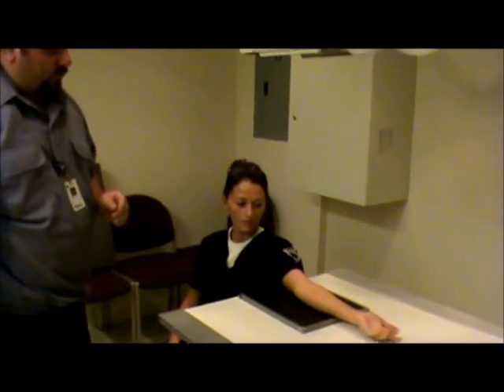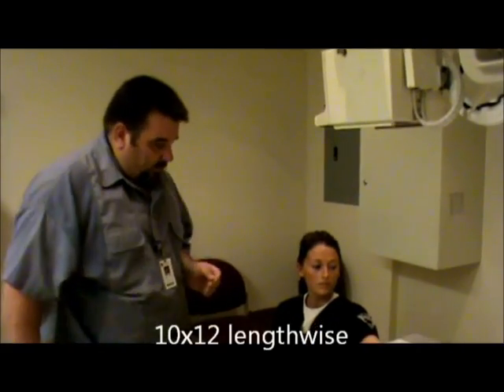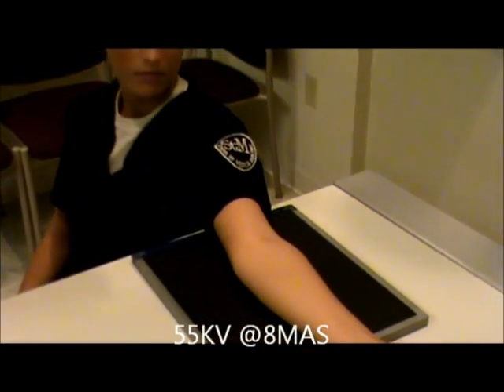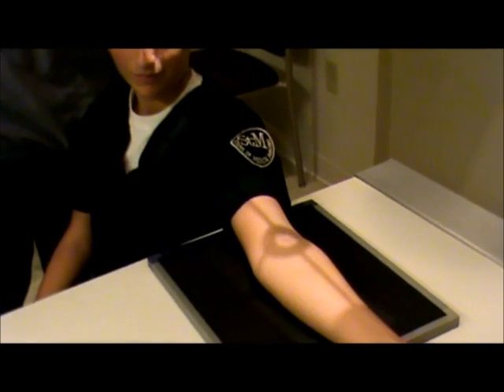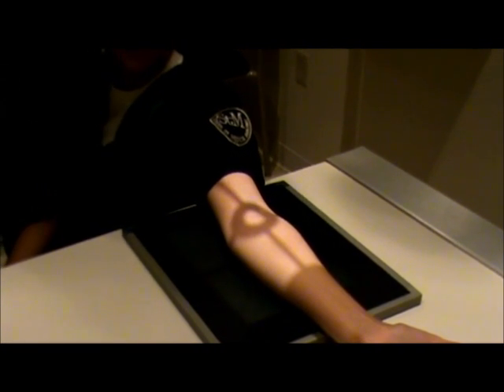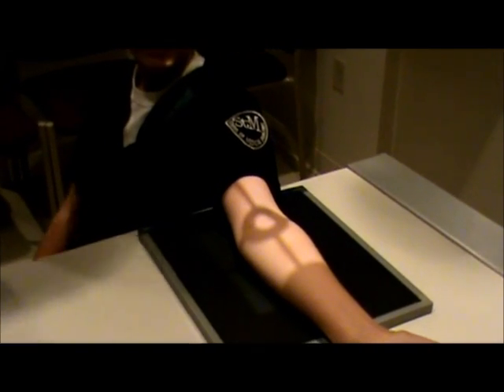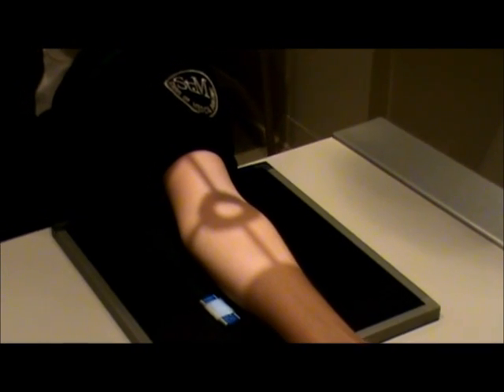We're going to have a 10 by 12 film size. Technical factors for this are going to be 55 kV at 8 mAs. We're going to center the patient the best we can to the center of the film. We want to palpate the epicondyles, verifying that they are parallel to the IR, telling us it's an AP position. The centering point for this will be at the mid elbow joint. We will be in the light field, but not obstructing any pertinent anatomy. This will be our AP position of the elbow, and now we will make exposure.